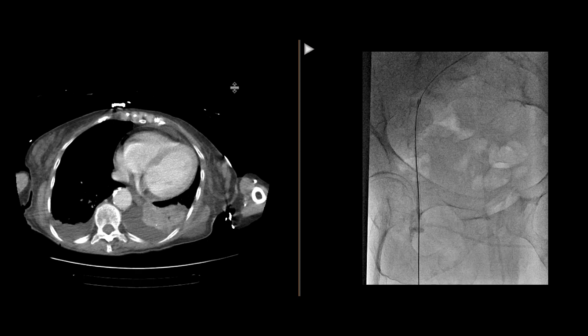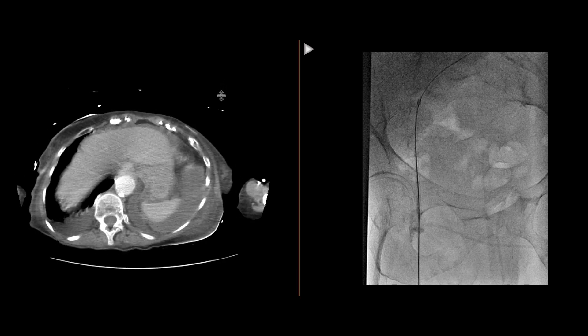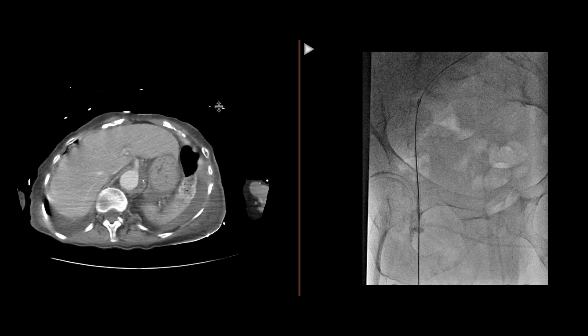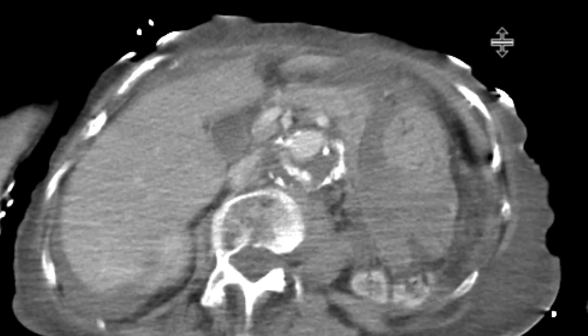This is a patient who has abdominal distension and a drop in hemoglobin. A CT scan is obtained with intravenous contrast. As we scroll down, you can see a few things that are abnormal.